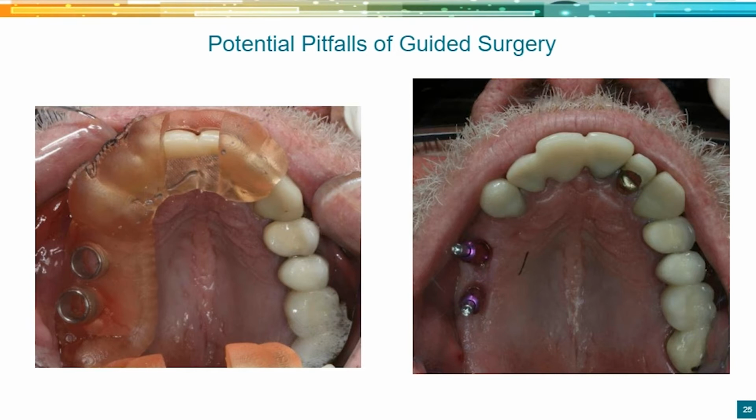And luckily it was still in bone, so of course it healed. And one of the rules of thumb is a poorly placed implant will heal every time. And so now you're stuck with a restorative compromise, and you have to get kind of clever here, right? So be mindful of what the support is on your guide.